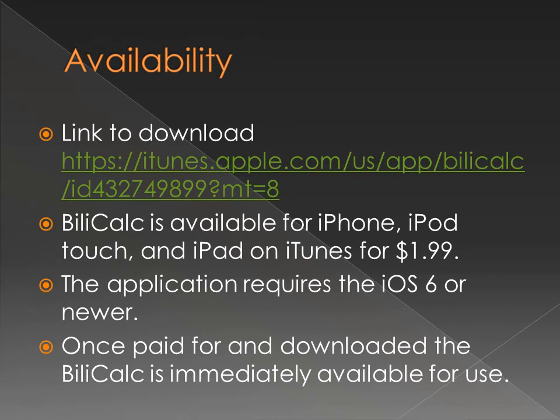This application is easy to download from iTunes and it costs $1.99. The application is intended for healthcare professionals such as pediatricians, neonatologists, nurses, and medical students. The application requires iOS 6 or newer, but once you pay for it and download it, it's immediately available for use.